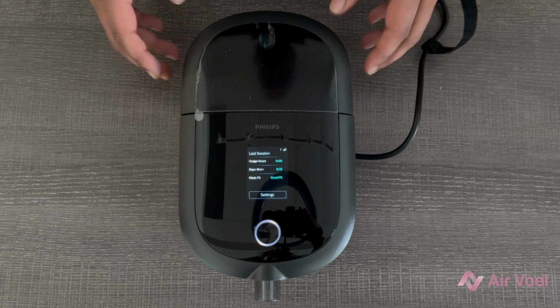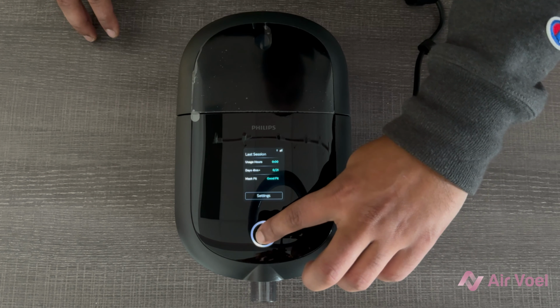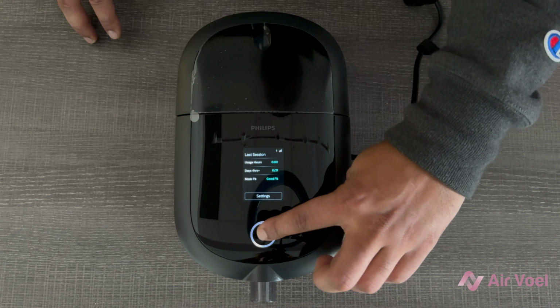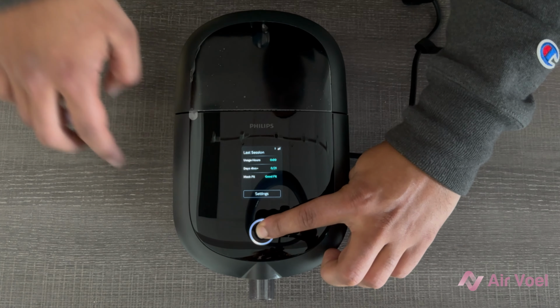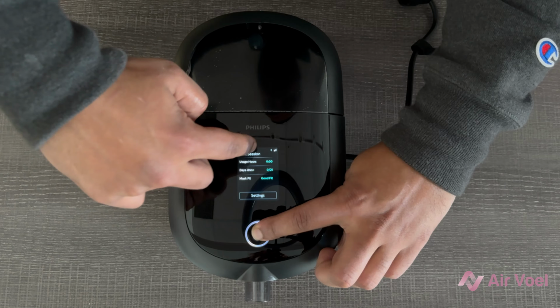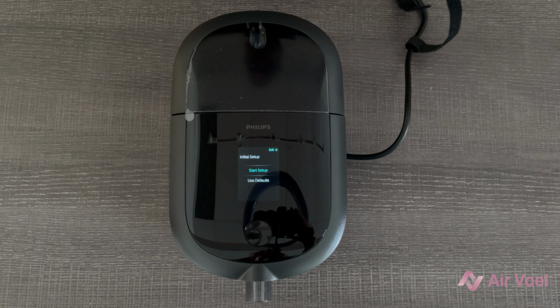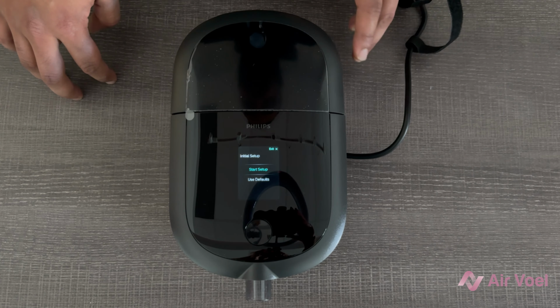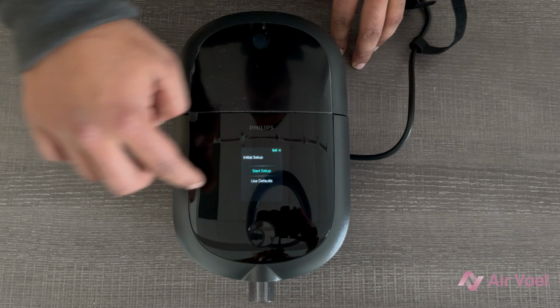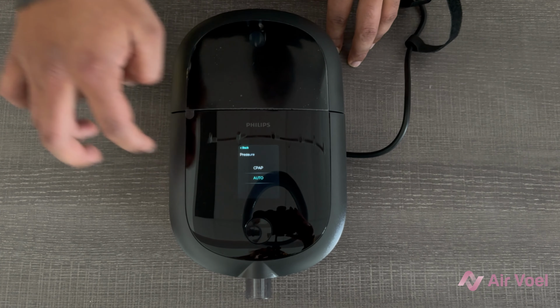Okay, to access the clinical menu, you're going to press and hold the main power button that's below the screen. You're going to press and hold it until you see the light flash around it, and then you're going to swipe downwards on the screen from last session while still holding that button. And when you do that, you are then going to enter the clinical menu, where you can start the setup.